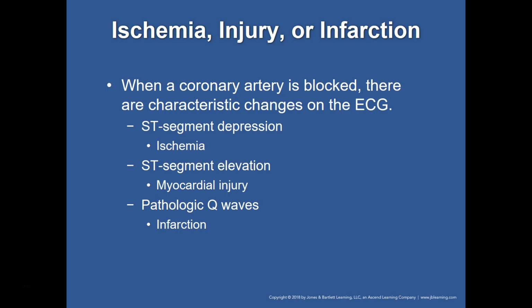Now, it's not uncommon to see a Q wave. It's uncommon to see a pathological one, which means that the Q wave measures out to be about 25% of the height of the QRS. That's the big factor for making that Q wave into a big deal.